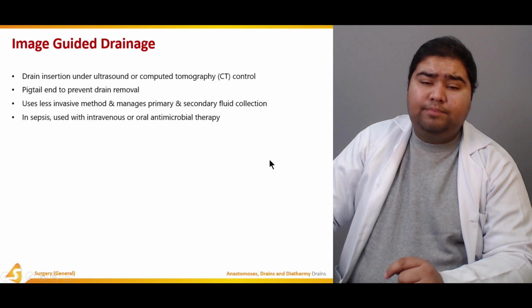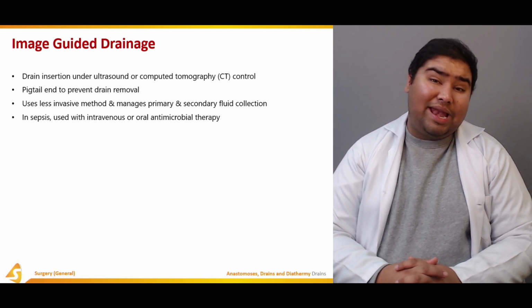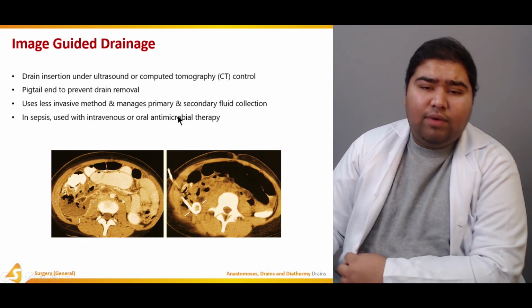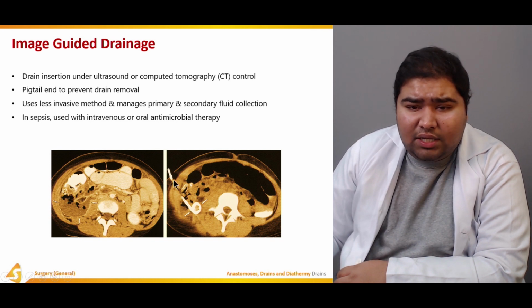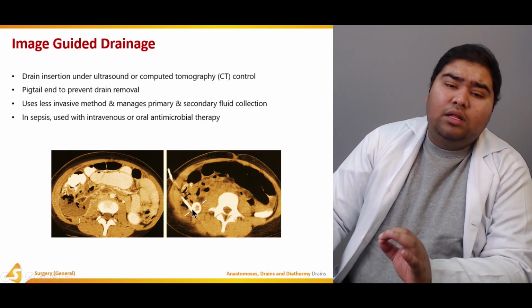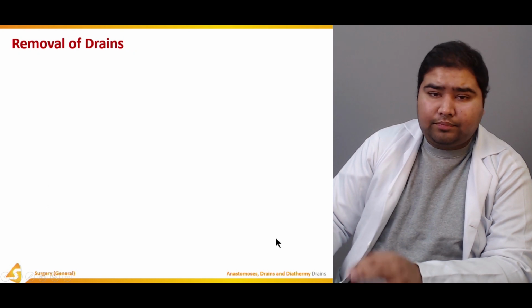In sepsis, they are used with intravenous or oral antimicrobial therapy in an attempt to improve the patient's outcome. So here you can see an image guided drain. This is a CT scan of a patient and this is an image guided drain being placed, and through this drain the fluid is being collected and drained out of the body.